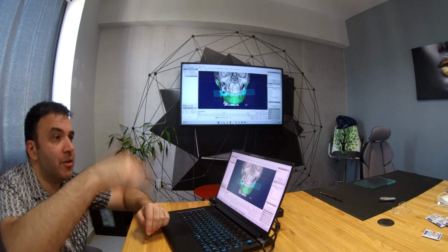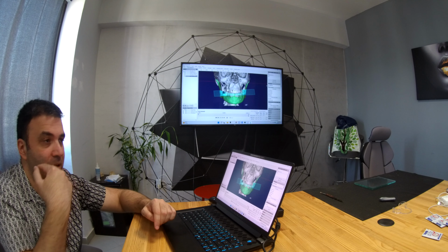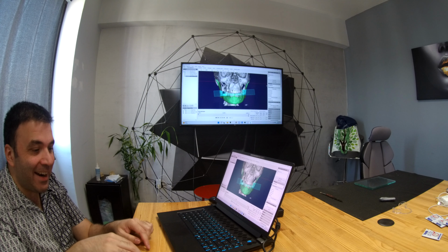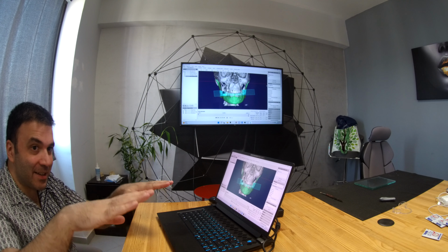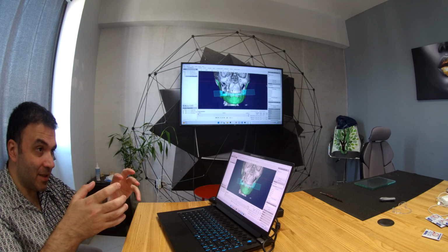Remember I told you it's better to have contact between the incisors and the bite fork. I remember the relative position according to the T-line. So I placed the anterior teeth in contact, and the posterior teeth were hanging. But I think that helped me to be precise.